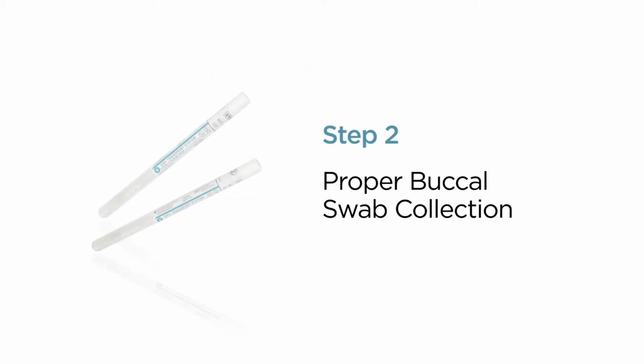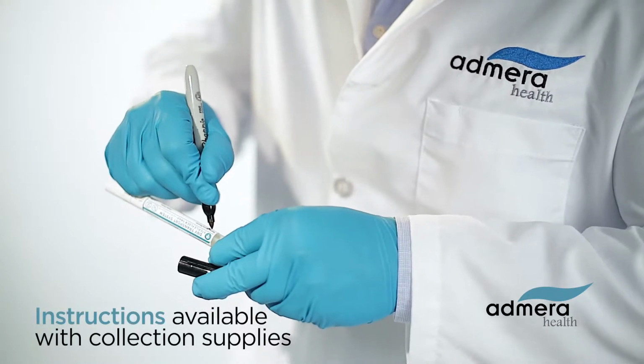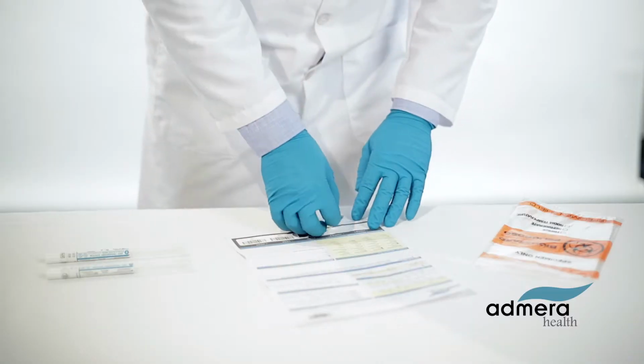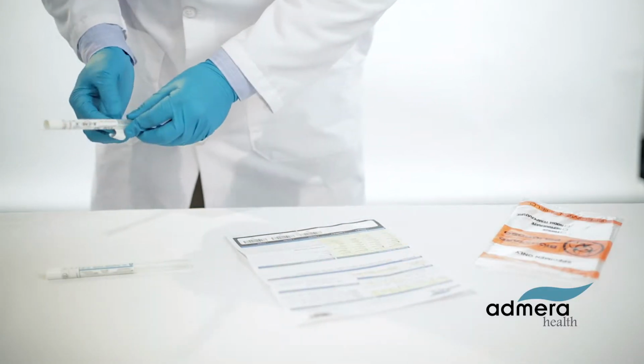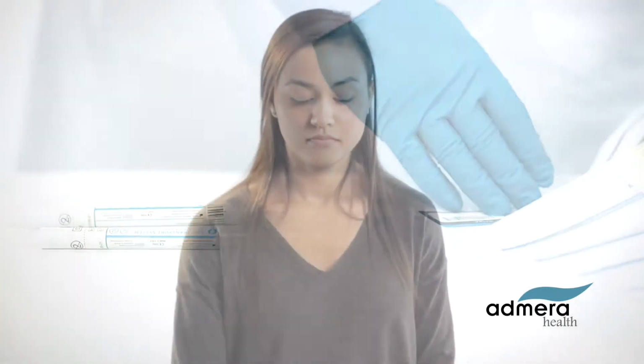Step 2. Proper buccal swab collection. Print patient name and date of birth on the tube's label using ballpoint or permanent pen. Affix 1 barcode sticker from the test requisition form to unlabeled portion of each buccal swab tube. Have patient rinse his or her mouth with water immediately before specimen collection.